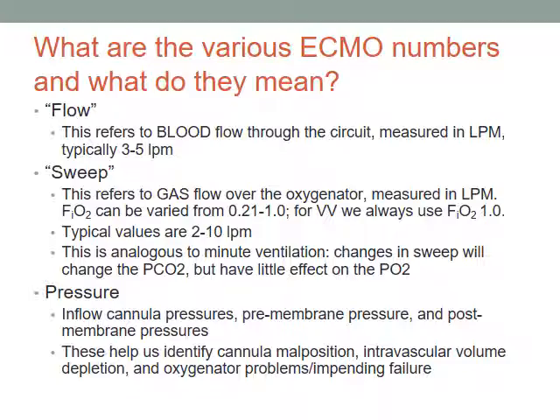We follow them actually hourly, but you need to keep track of them. They usually don't rise acutely, but they can. And these can be early signs of disaster waiting to happen: pressure changes that are not explained by anything else that you've done to the patient.